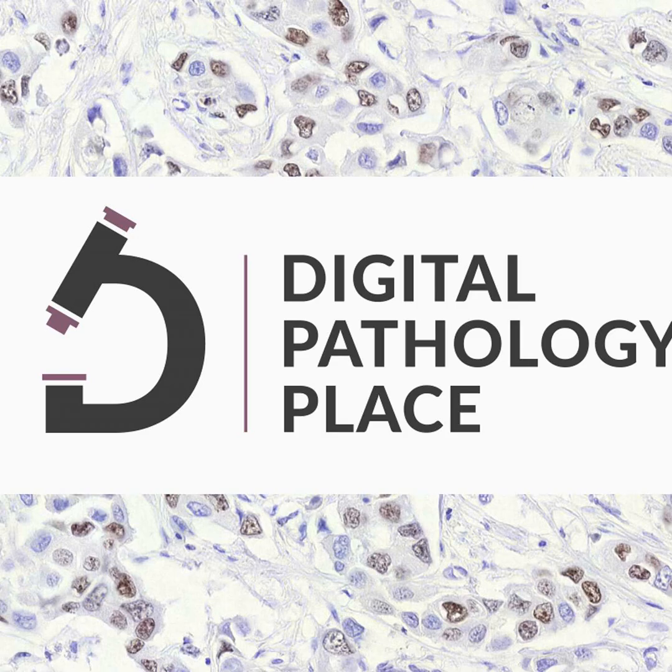One notable example of this is the PD-L1 immunohistochemistry test that is used alongside certain immunotherapy drugs. The test measures the level of PD-L1 protein expression in cancer cells, and this result assists doctors in deciding whether or not the patient is likely to benefit from the specific immunotherapy drug.